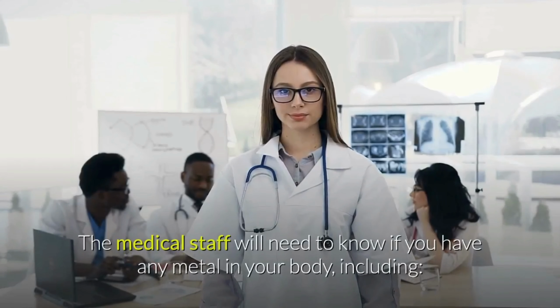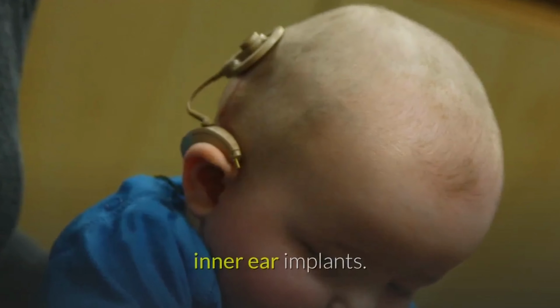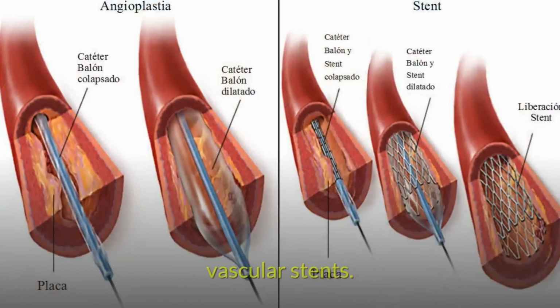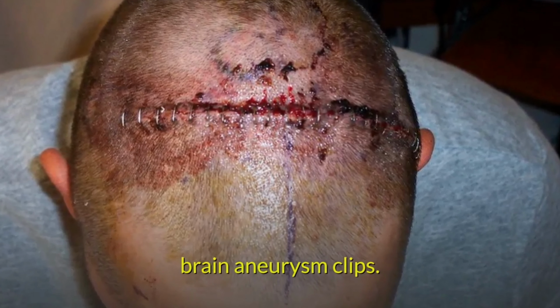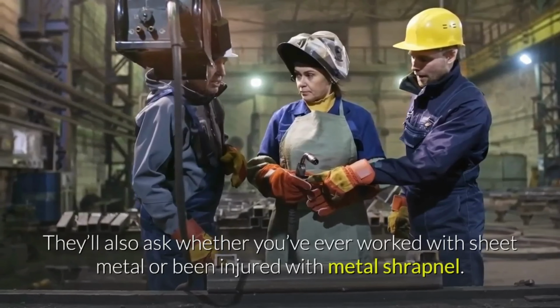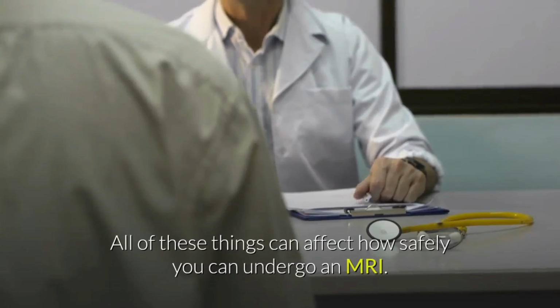How do I prepare for a head MRI? The medical staff will need to know if you have any metal in your body, including inner ear implants, artificial joints, or pacemaker, particular types of heart valves, vascular stents, brain aneurysm clips. They'll also ask whether you've ever worked with sheet metal or been injured with metal shrapnel. All of these things can affect how safely you can undergo an MRI.